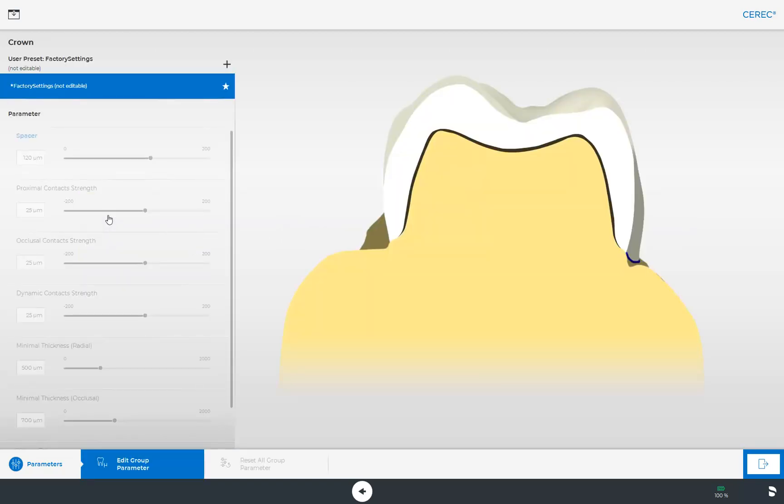First of all we choose the parameter settings for a crown. The parameters set here are used as default values for all initial proposed crown restorations. Since these are the factory settings which are defined by the respective material manufacturer, they cannot be modified.